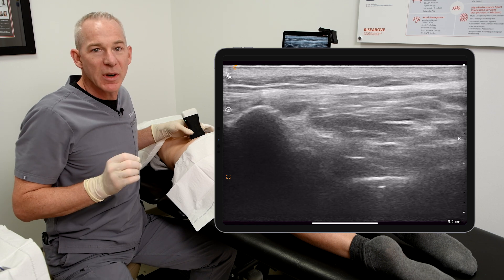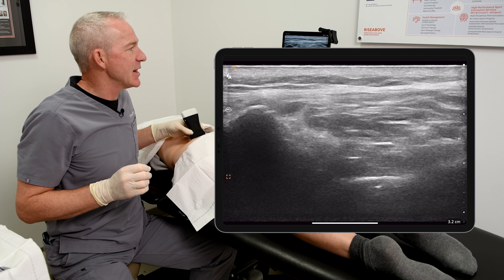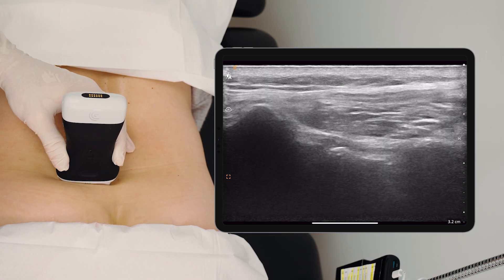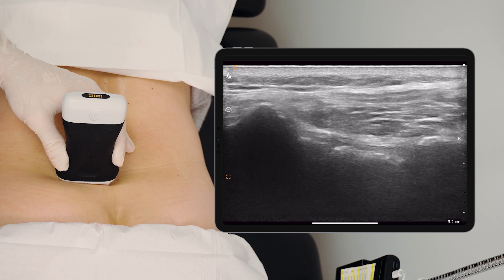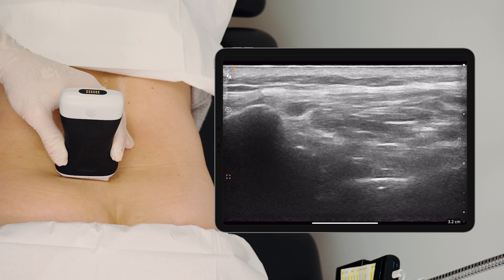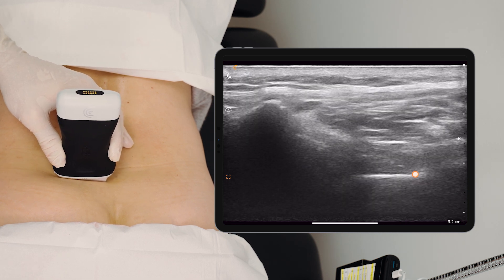Now, the number one reason you have to have some sort of image guidance with this is the following. If I slide slightly inferiorly, I see a break in the sacrum. This is the neural foramen at S2. I certainly don't want to put my needle here. So we're going to slide back up until I can very clearly see solid bone on the sacrum, and then know I'm safe to inject.